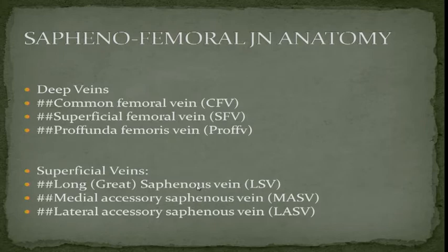It's not a quick in and out exam. Look, put the probe on, gallbladder calculus, yes or no, and move out. No, it's a very tedious exam. And it was very tedious for me to teach it to them, and very tedious for them to perform it initially, and now they're picking up some speed there.